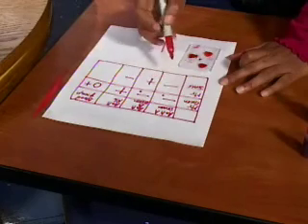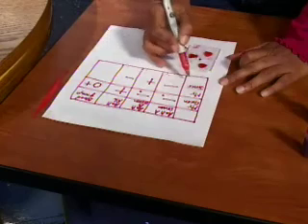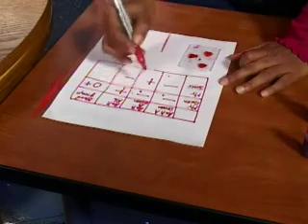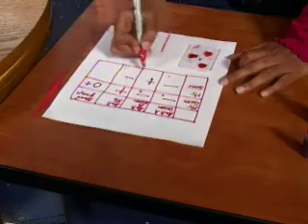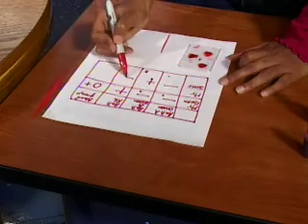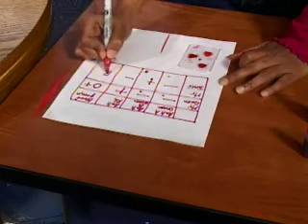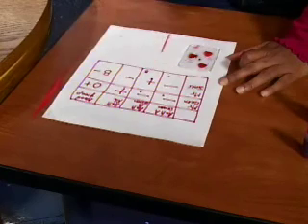Let's look at the next one. There was no agglutination with anti-A serum, so that means this did not contain A antigen. His cells did not contain A antigen. It agglutinated with the anti-B serum, so that means it did have the B antigen, so B was present. But again, there was no agglutination with the anti-RH serum, so that means it does not have the RH antigen. So this blood group would be B negative, because there is no agglutination with the anti-RH.